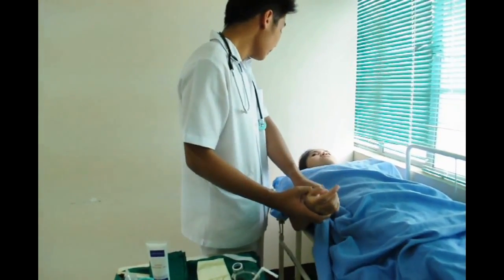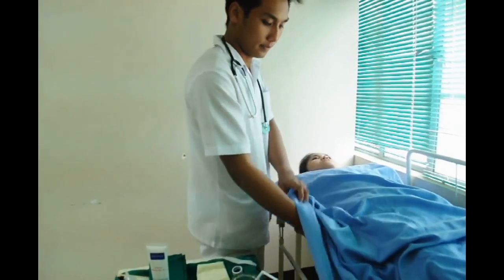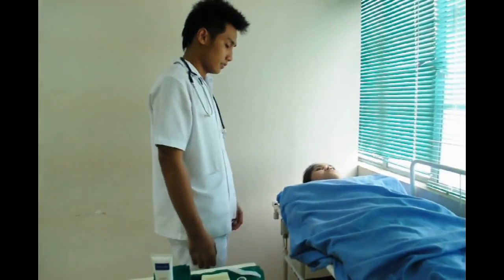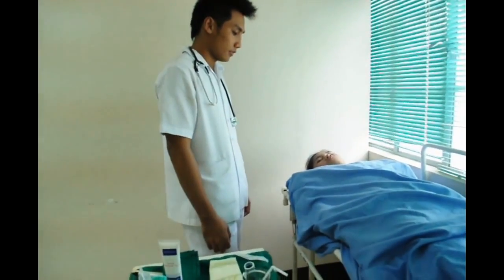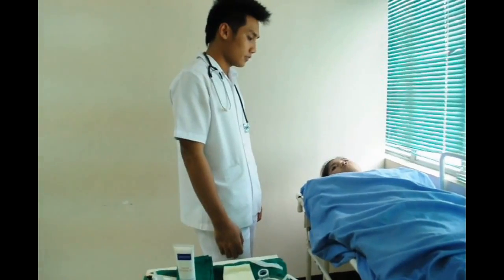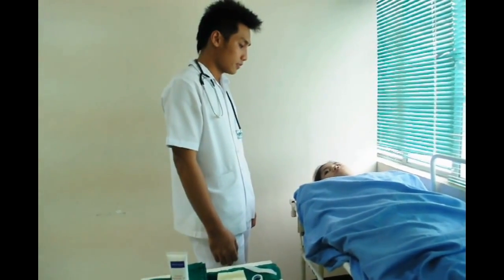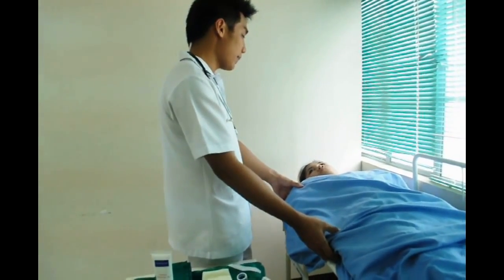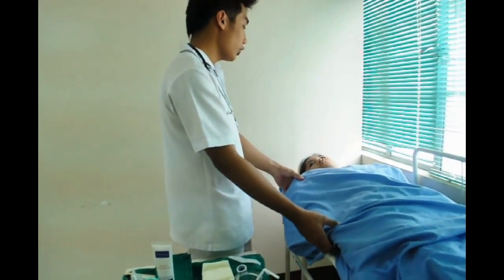Miss Aguanta, right? Now, Nurse Christian is going to explain the procedure to the patient and provide the rationale for why the tube is needed. Patient cooperation is facilitated when explanations are provided. Ma'am, we'll be inserting your nasogastric tube today for the passageway of your meals and your medication.